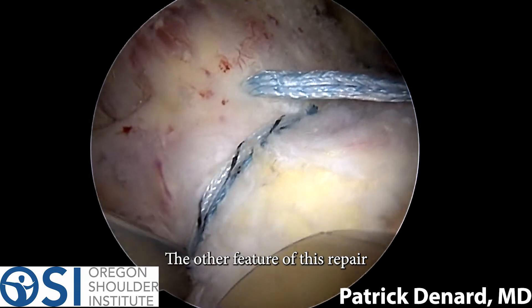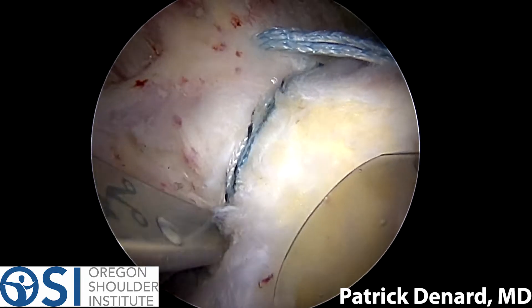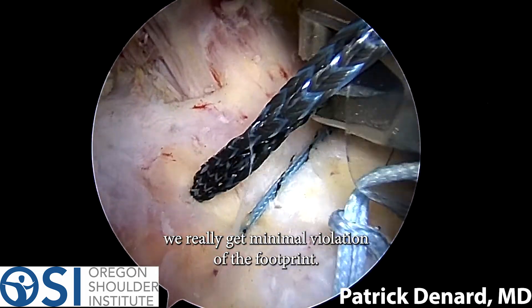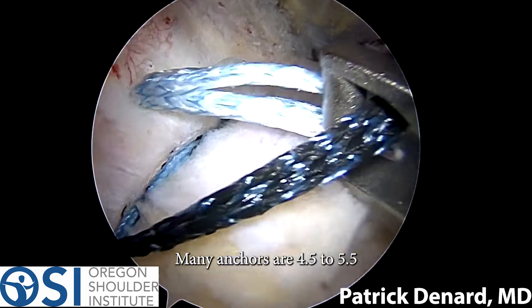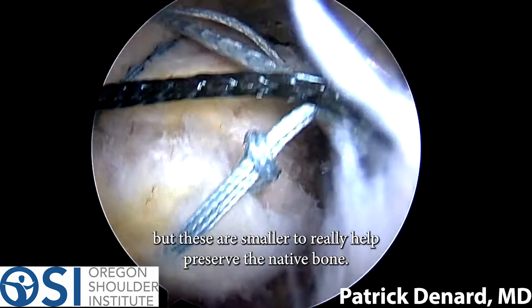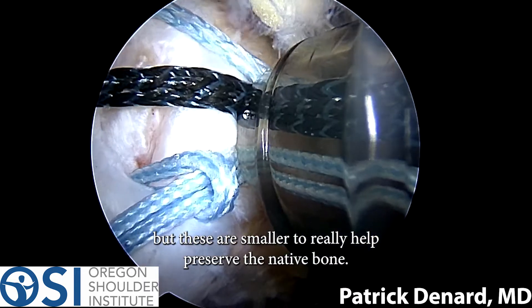Another feature of this repair is that by using these small anchors, you get minimal violation of the footprint. Many anchors are 4.5 to 5.5 millimeters in size, but these are smaller to really help preserve the native bone.